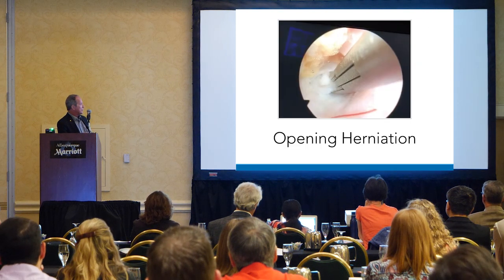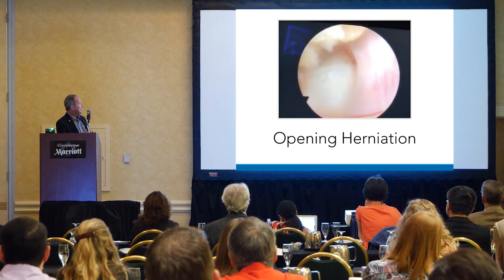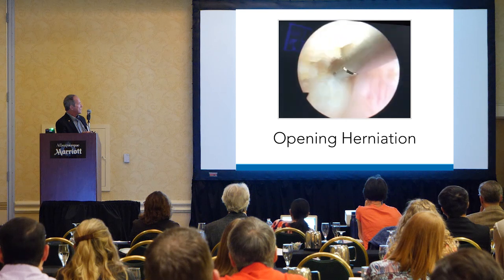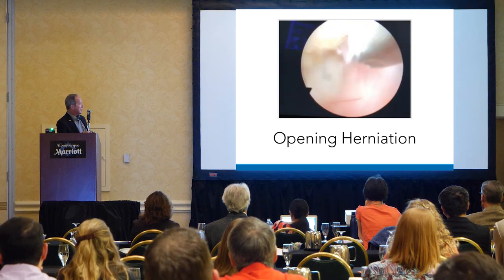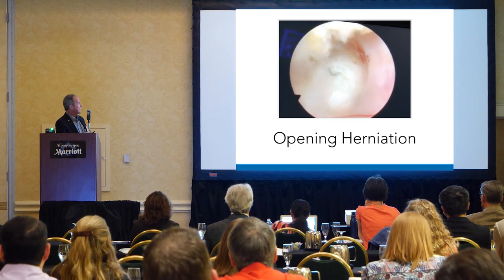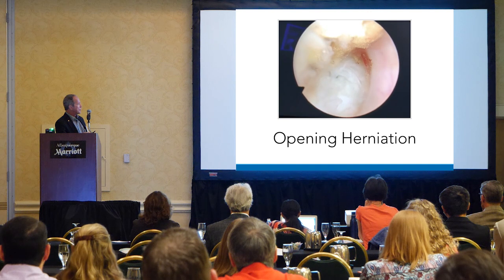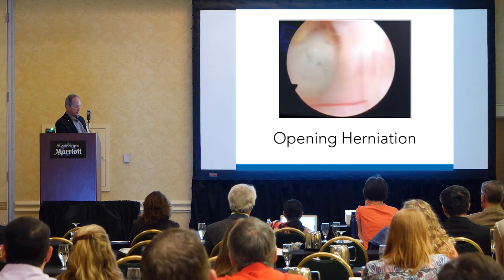Now we're going to open the herniation with the basket forceps, the little scissors. And these are going to be some sizable fragments that I think, again, would be pretty hard to pull out through the anterior approach if one decided to do that. With the anterior approach, you might be able to debulk it, but I don't think you're going to have as good of a discectomy as you're going to see right here.